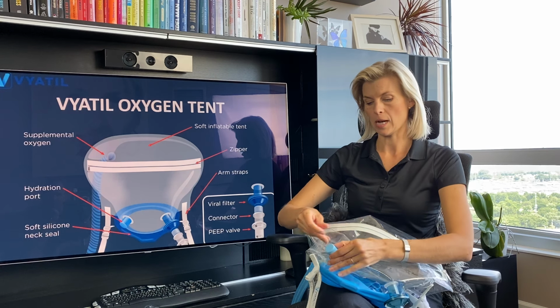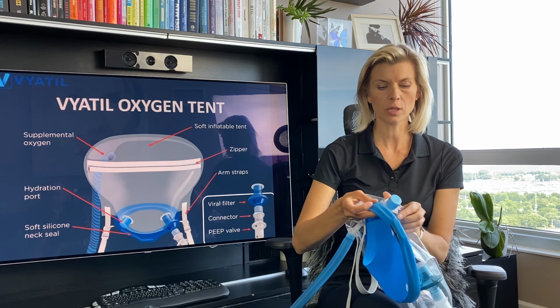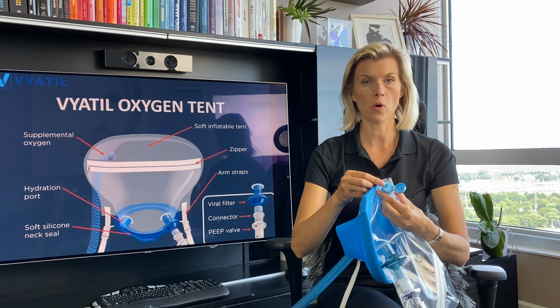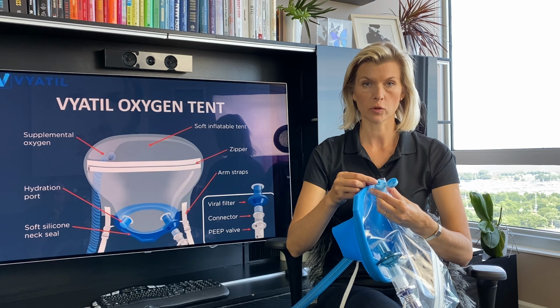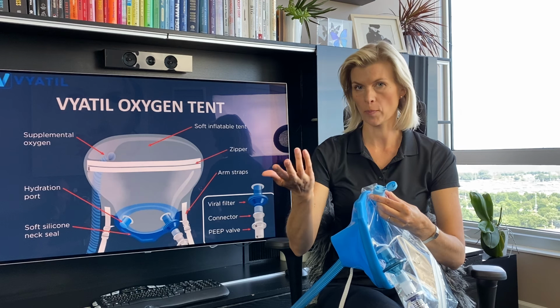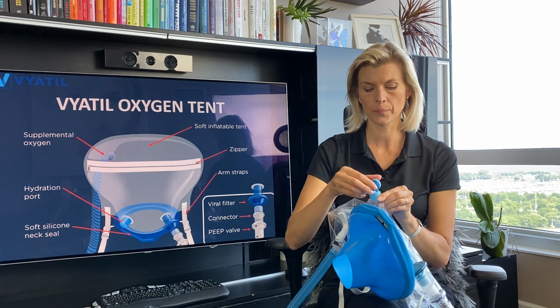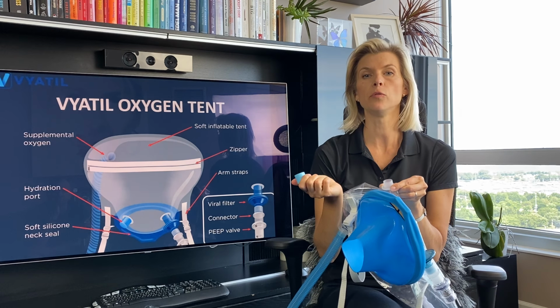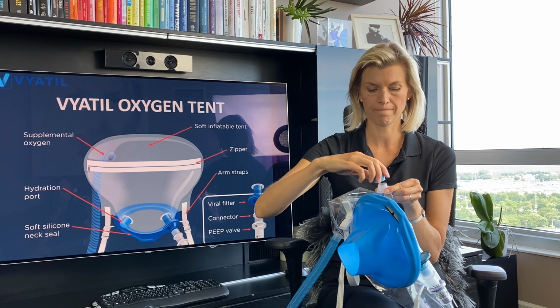Also, this is our patient access port. It's nice that you can open the cap, and this is a small hole that can be used to insert a straw so the patient can take oral fluids, or the cap can be removed in case you need a quick suctioning.